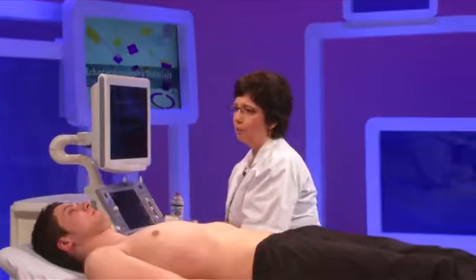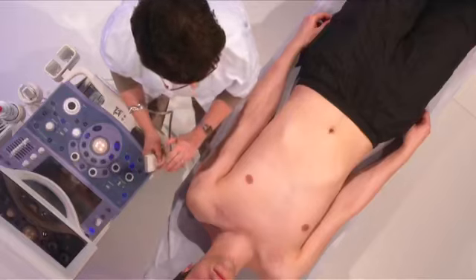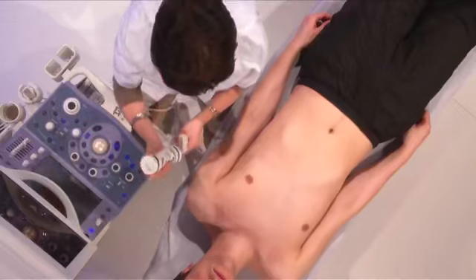Today I'm going to show you how to perform a carotid examination with echo Doppler, and especially how to assess the severity of the carotid stenosis. A very important thing, of course, before beginning is your position. You can stand at the head of your patient, but if you're a cardiologist, you will probably prefer to sit at his side, on the left side or the right side, as you prefer. So we're going to begin.